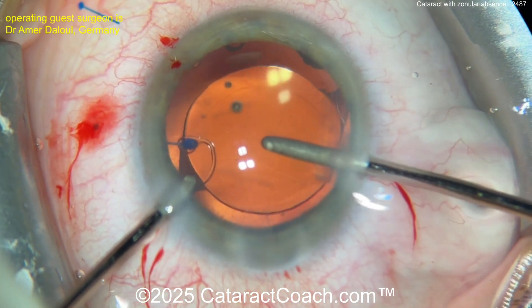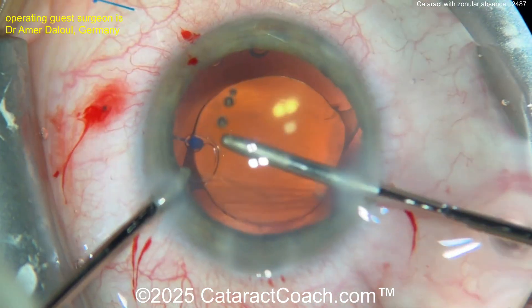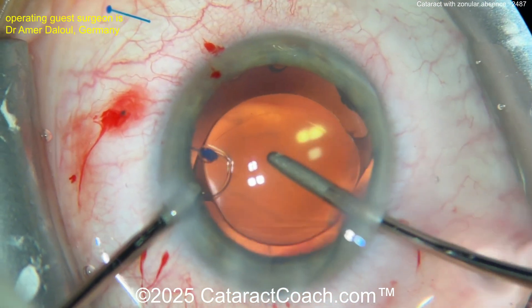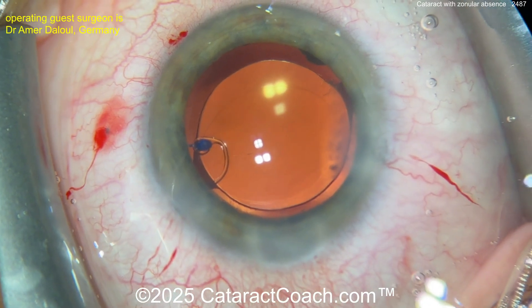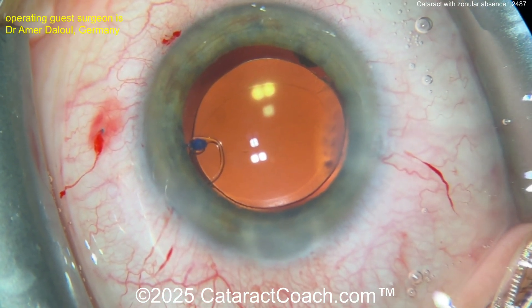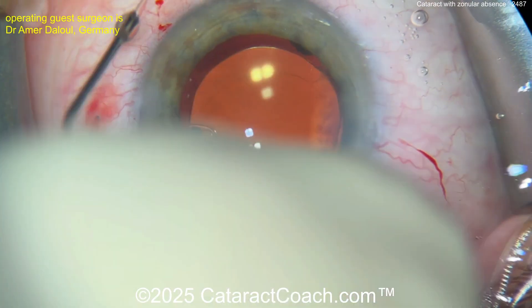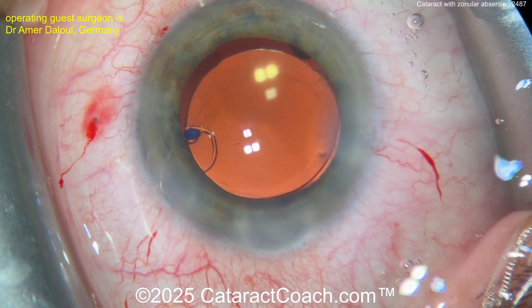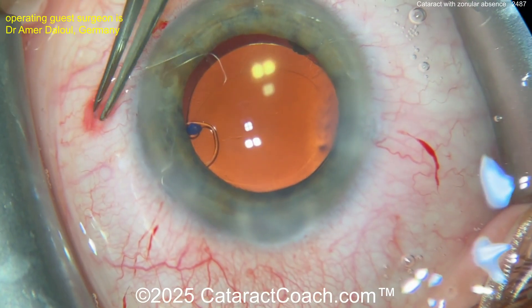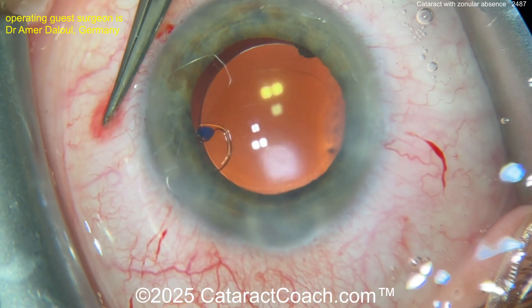Now taking out the viscoelastic — I'd like to put in some triamcinolone just to make sure there's no prolapse of any vitreous. Nicely removing everything and that looks pretty good. Wow, very nice! Put some Miochol in there and bring the pupil down — and look at that, it's going to have nice long-term stability. Beautiful case, fantastic technique!